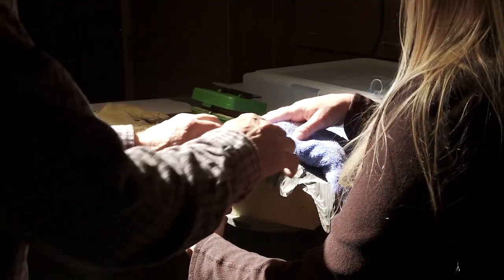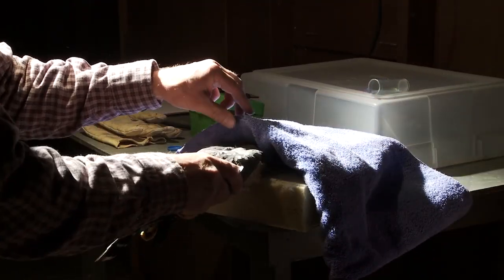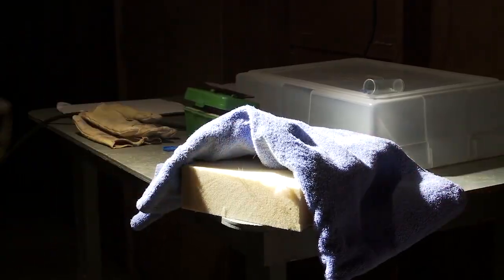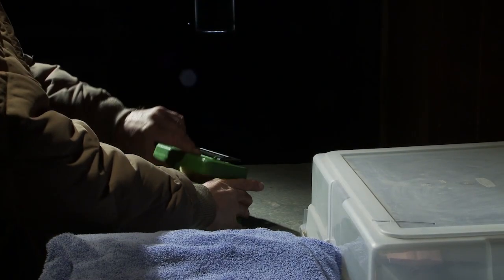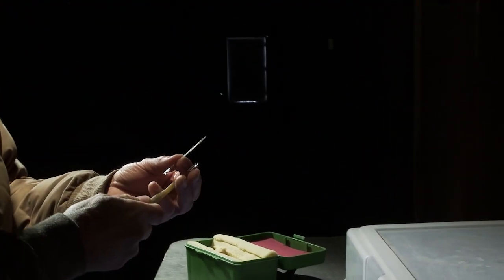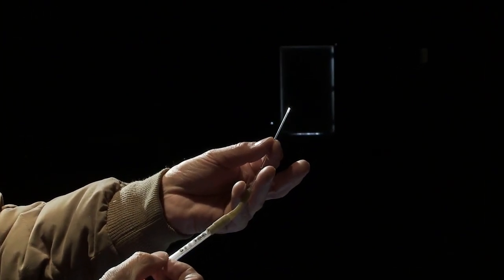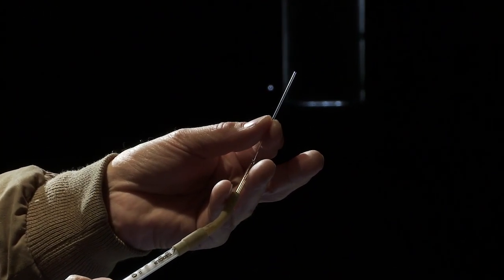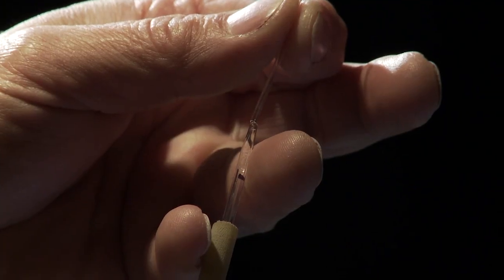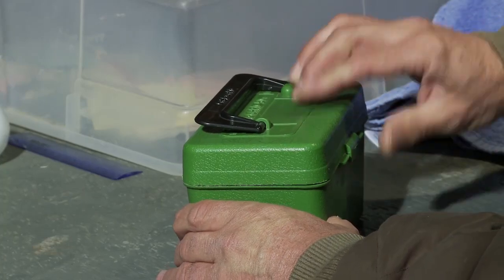The male is then released back into the chamber. Cal immediately places the semen into the warm artificial insemination tube in preparation to inseminate the female. Artificially inseminating the female is a very quick process, so we prefer to do the procedure in the chamber.